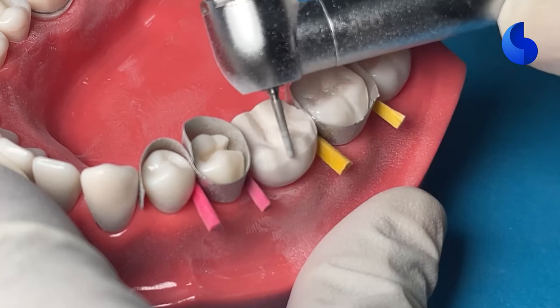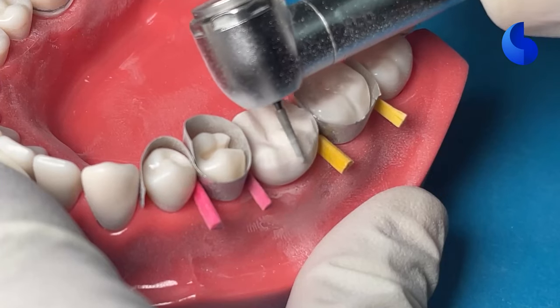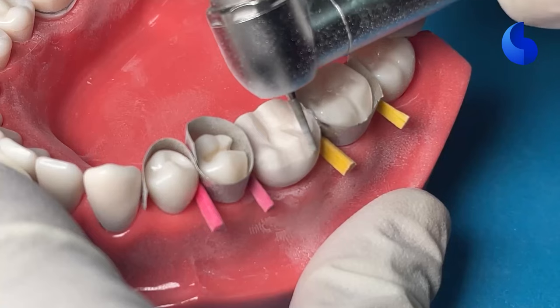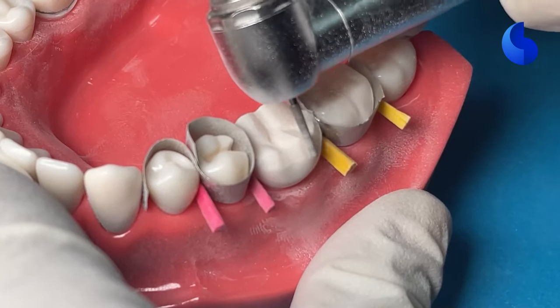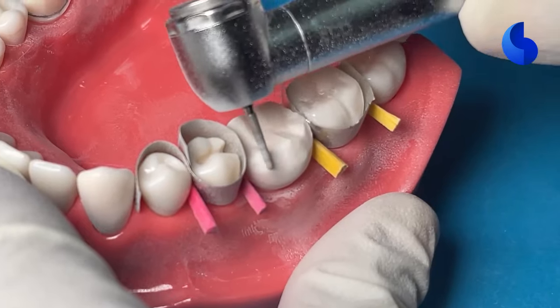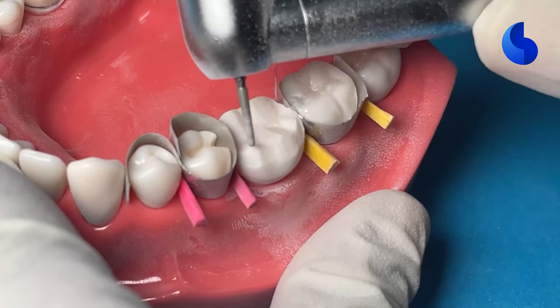So as you can see, we are really ensuring that the functional cusp bevel is prominent. And while you're doing that, make sure that you're not nicking the adjacent tooth. Here again, we have protected the adjacent teeth with matrix bands. You can also use a fender wedge to do that.